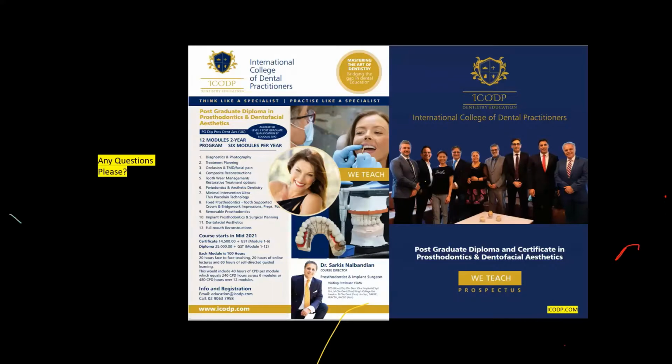Dr. Sarkis, may I ask a question? Go ahead, Hamza. What other material apart from zirconia could you use for the anterior? In this particular case, I would use metal ceramic, with a good 1 mm gold margin just to grab the root. There's no question about it. Especially high gold noble alloys. Those crowns are not cheap, about $650. Besides being high gold, we also gold plate them. They give a nice yellow effect and beautiful aesthetics, a very warm color.